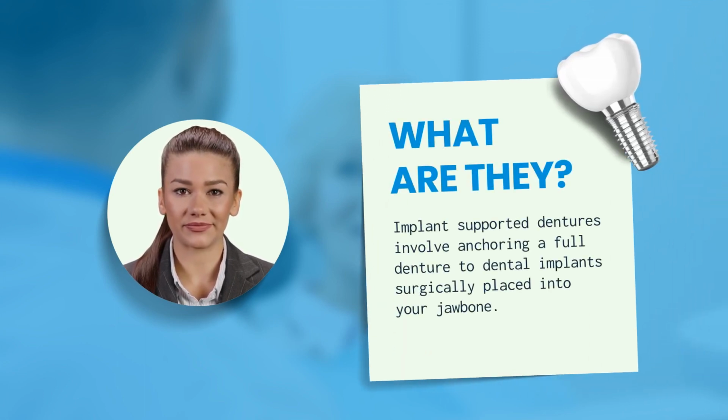First off, what are implant-supported dentures? Implant-supported dentures involve anchoring a full denture to dental implants surgically placed into your jawbone. Usually, 4 to 6 dental implants are utilized to anchor down the denture.